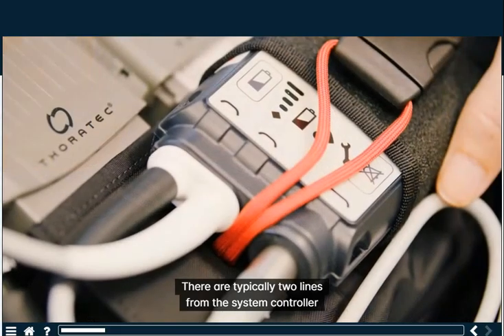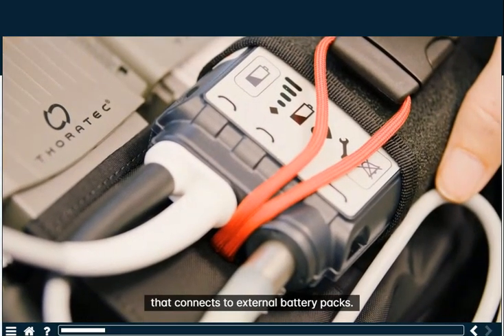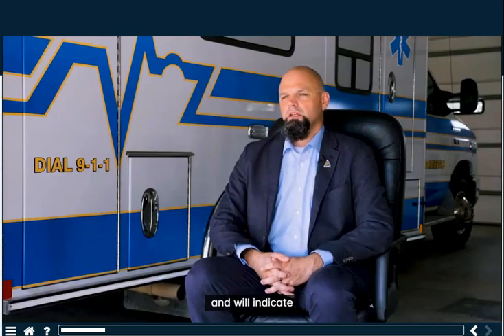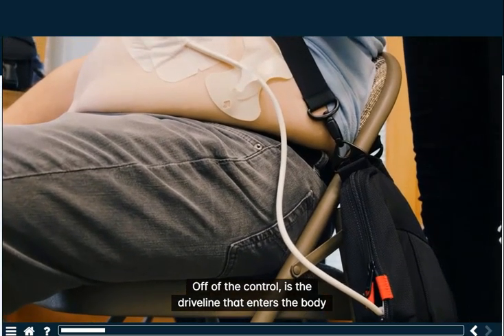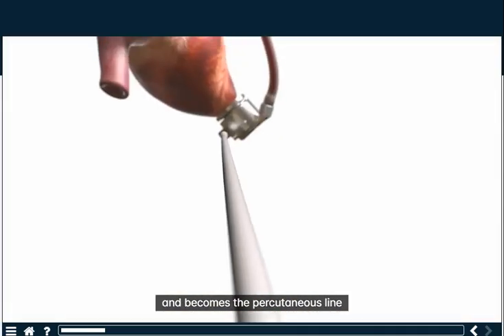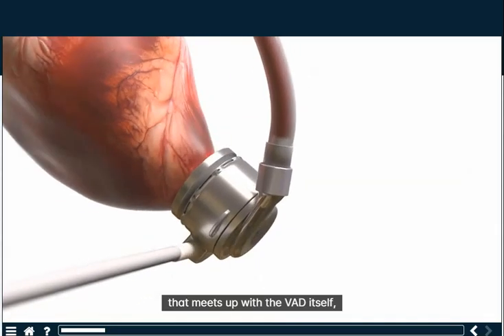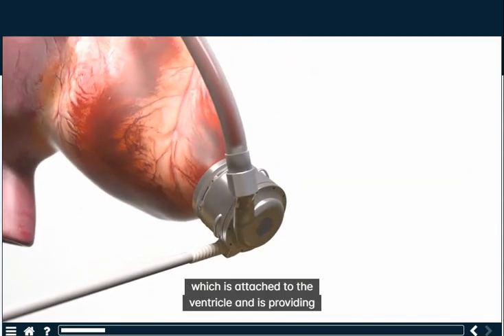There are typically two lines from the system controller that connect to external battery packs. The controller sits outside the patient's body and will indicate that the pump is functioning appropriately. Off of the controller is the driveline that enters the body and becomes the percutaneous line. That meets up with the VAD itself, which is attached to the ventricle and is providing that continuous flow to the body.